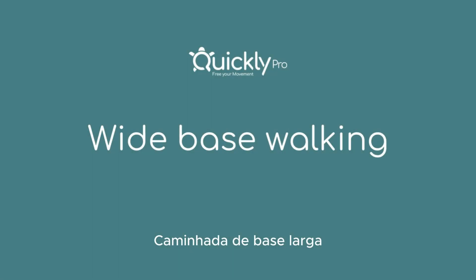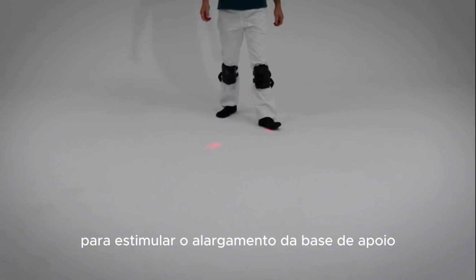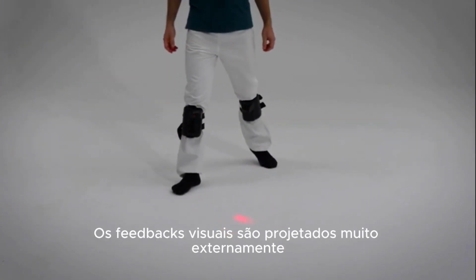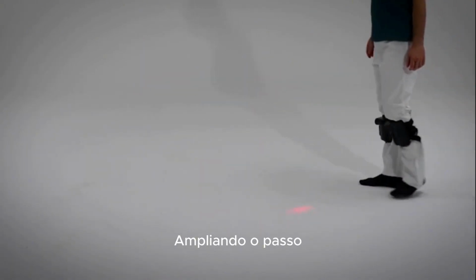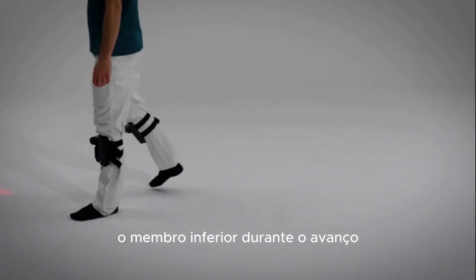Wide base walking. Specific gait training exercise to stimulate the enlargement of the base of support. The visual feedbacks are projected very externally so that the patient can reach them by widening the stride. It is very important that the patient does not extra-rotate the lower limb during advancement.